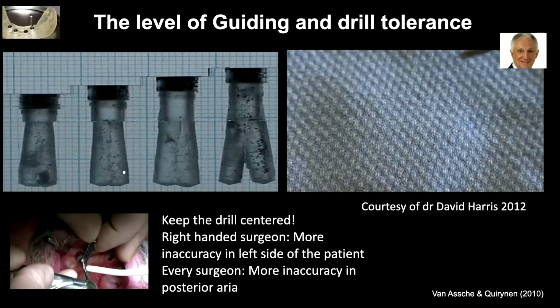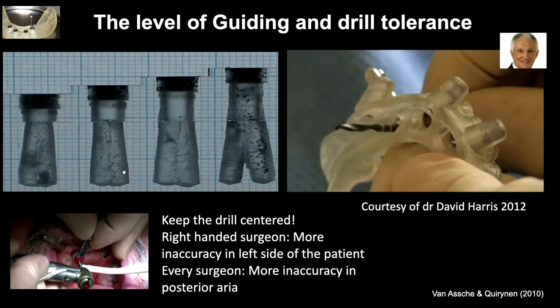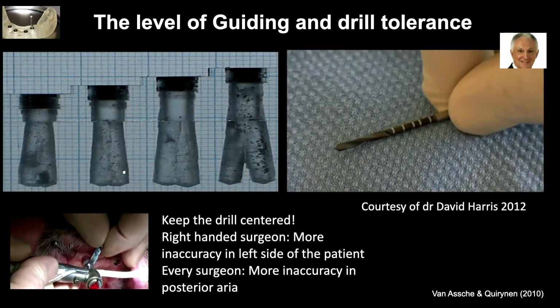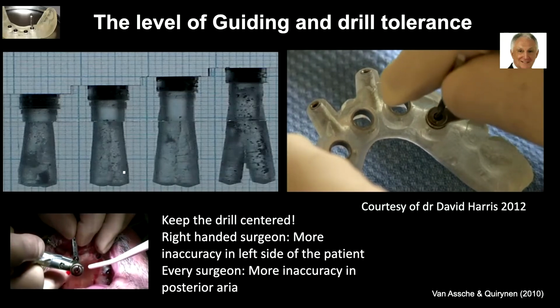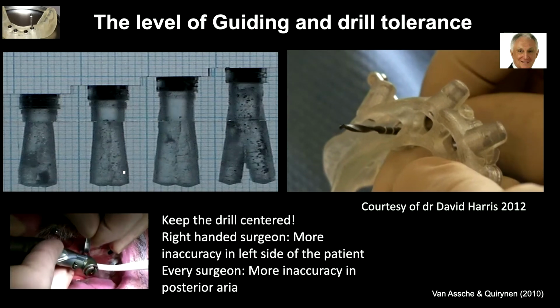Another thing is that they said, please keep the drill centered if you use those drills. If you look at the movie on the lower part, the guy is going in and out of the drill guide. Don't do that, because every time you go out and go in again and don't center it, you are creating another osteotomy. So this is important. If you're really doing this kind of technique, using these kinds of drills, you have to be pretty experienced and really be awake when you're doing these kinds of surgeries.